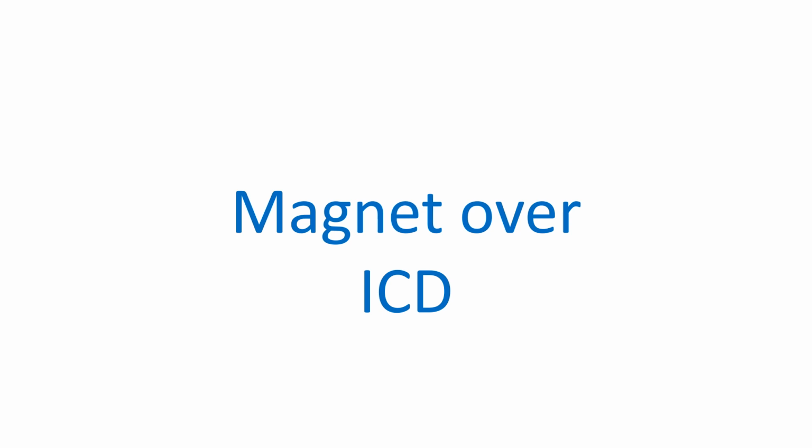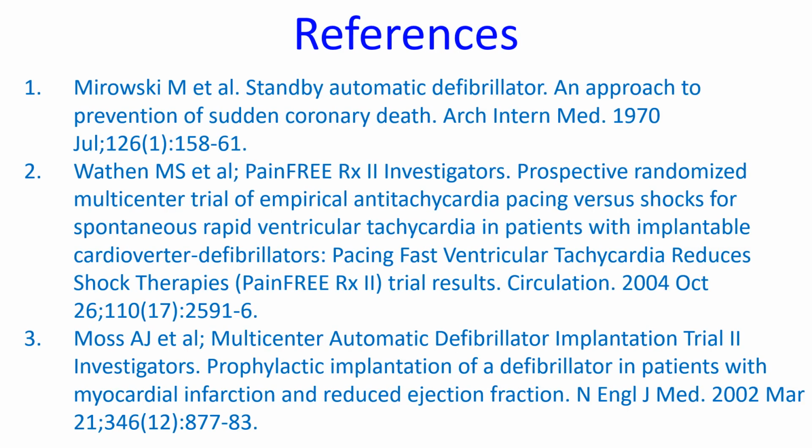In other situations, like while surgery using electrocautery are being planned, it is possible to suspend ICD therapy by applying a magnet over the ICD when a programmer is not available. Precautions with electromagnetic radiation and magnetic resonance imaging are applicable to ICDs like pacemakers. This is only a brief overview about ICDs as the topic is very vast with so many ramifications.